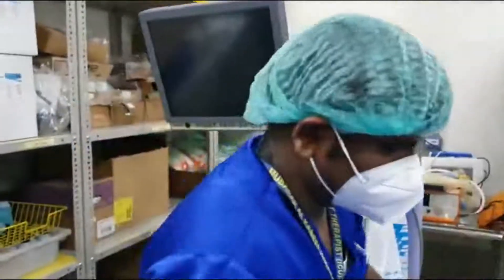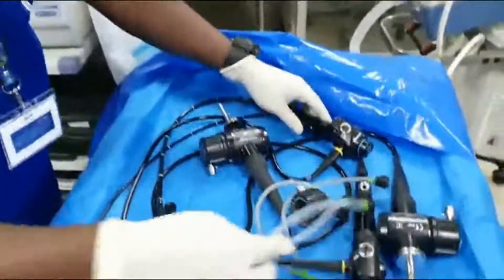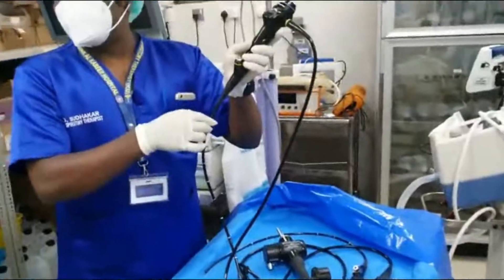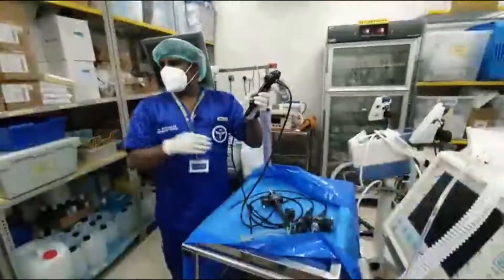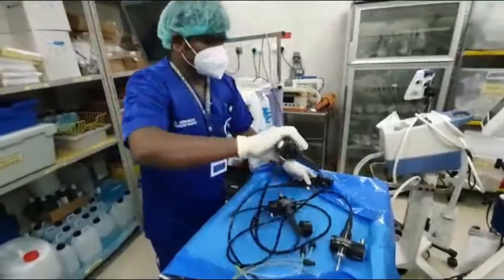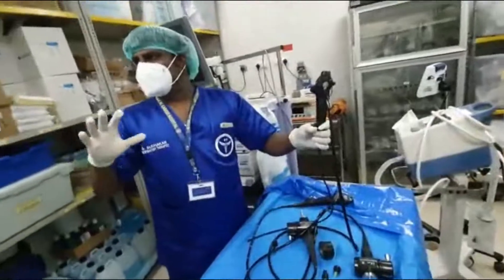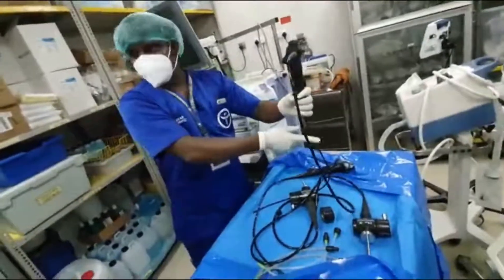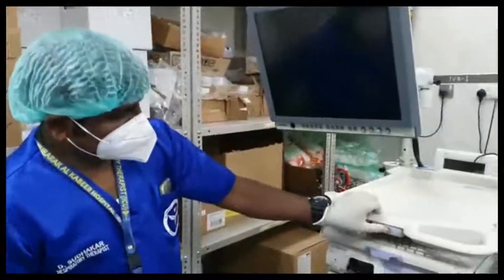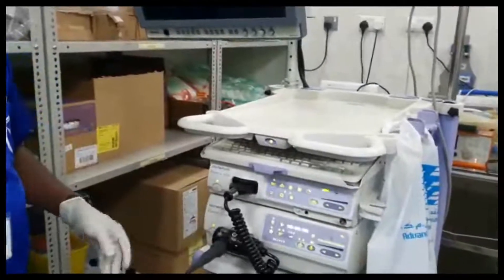We already washed the scope and kept it ready. We have two different scopes: the big one is the 8mm scope, which fits only an 8 or 8.5 size tube. If the ET tube is 7.5 or 7, you use the 6mm smaller scope. For female patients intubated on a smaller size tube or tracheostomy, always use the smaller scope.